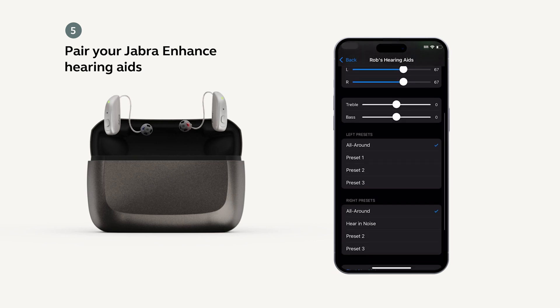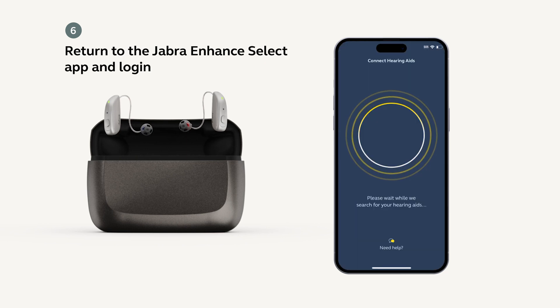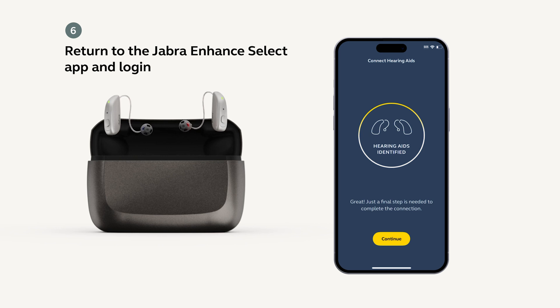Then return to the Jabra Enhanced Select app. Once logged in, your app will search for your hearing aids. If the hearing aids successfully connected in Accessibility, the app should display a message indicating that they have been identified.